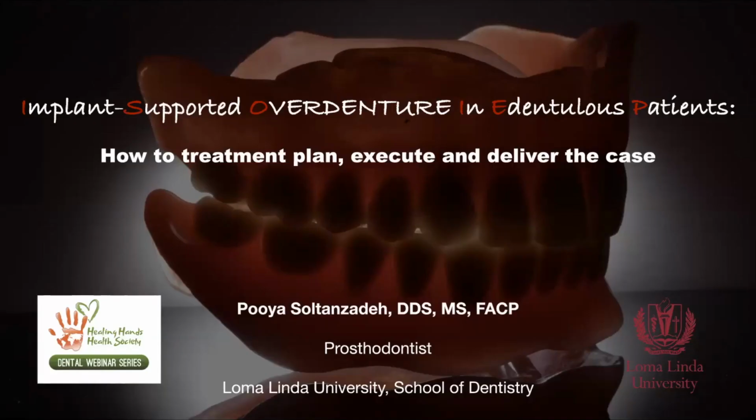Incorporated in my lectures too. For post-op, the hygiene after that is very important, and you should know all about it. Many clinicians are now talking about the tsunami of peri-implantitis in modern dentistry. This is because we all focus on placing the implants: remove the teeth, clean up the mouth, place the implants, put the prostheses, and then done.